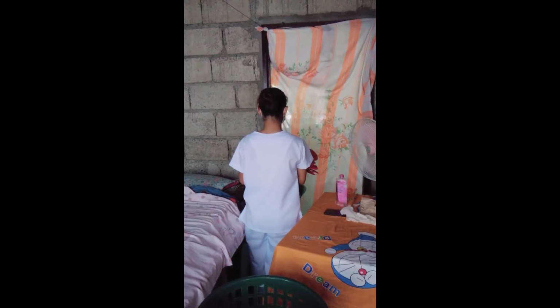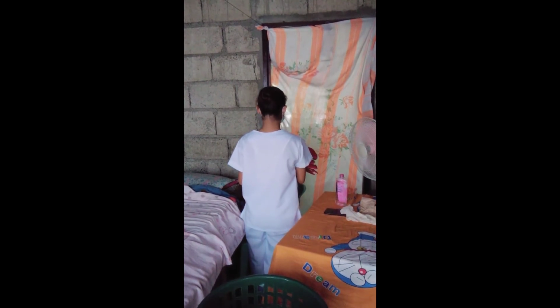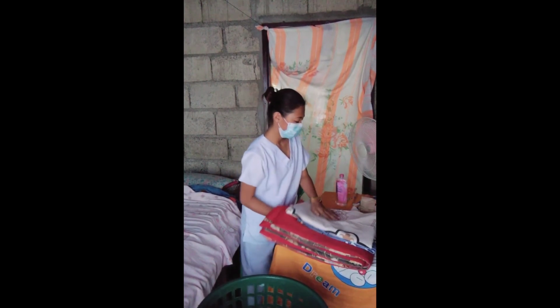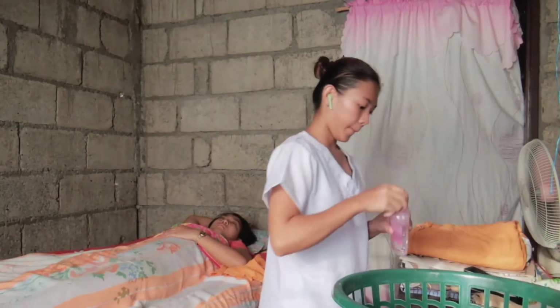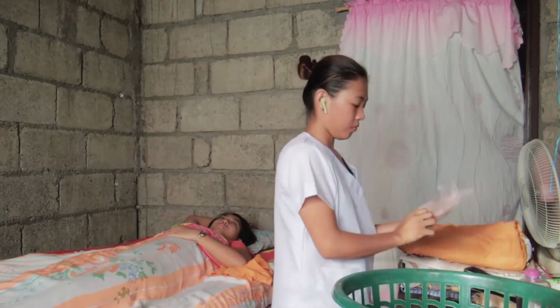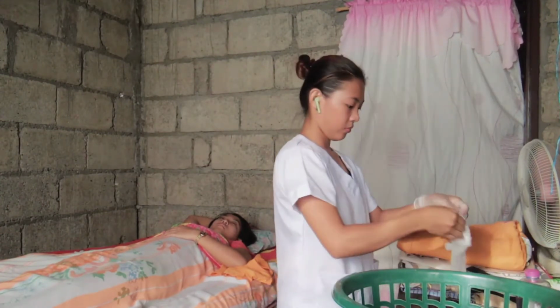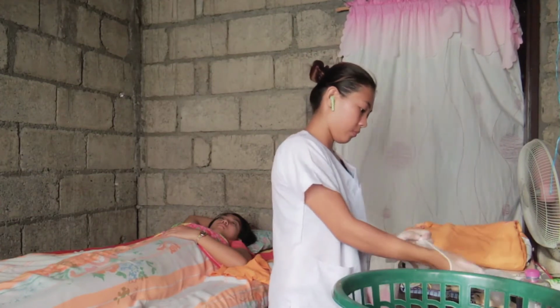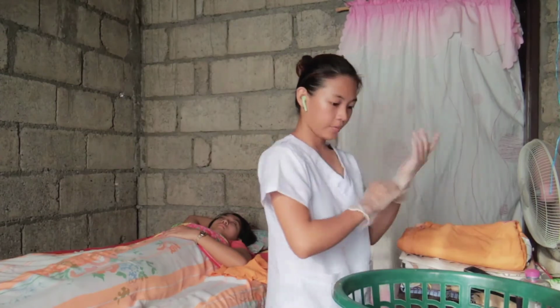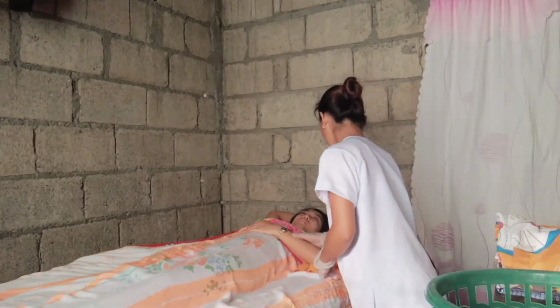To make an occupied bed, first consider the patient's condition and gather appropriate supplies, with the linen stacked from top to bottom. Place the clean linens on a clean surface, such as a bedside table. Now, perform hand hygiene and wear a pair of gloves. Adjust the bed height to a comfortable position.